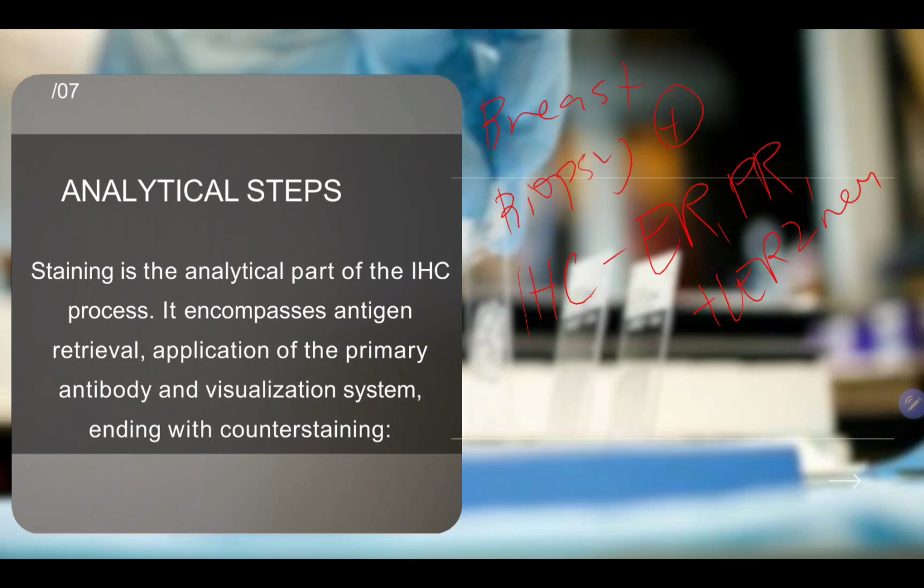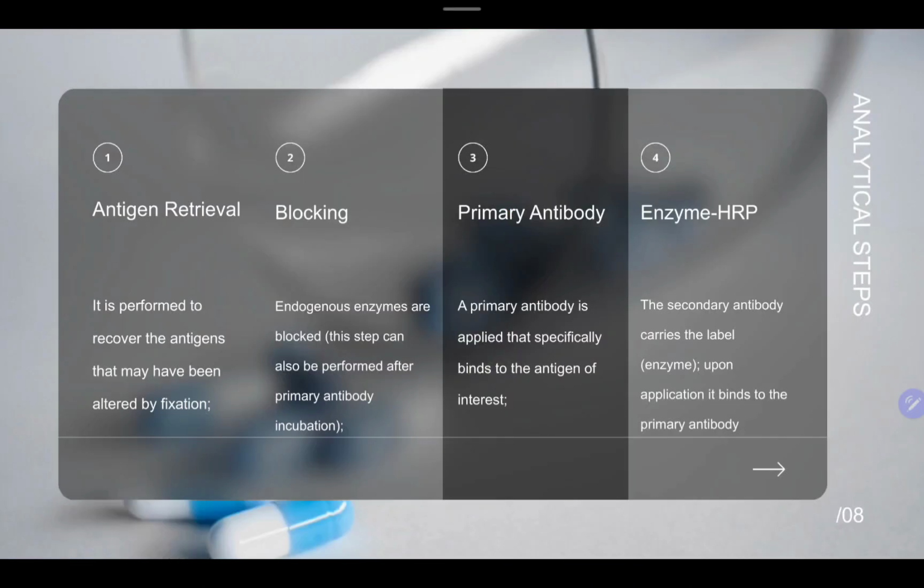Okay, so let's move on sa next slide para makita ninyo po. These are the analytical steps po. Una, we have the antigen retrieval. Antigen retrieval is performed to recover the antigens that may be altered by fixation.